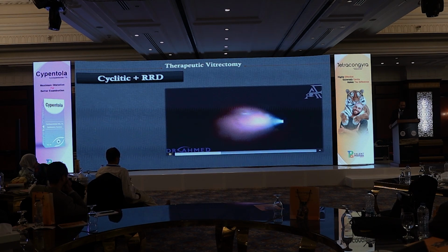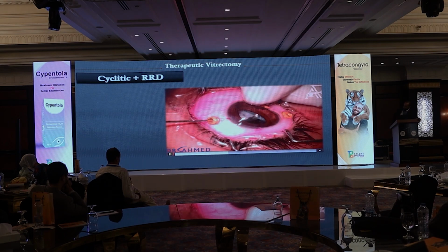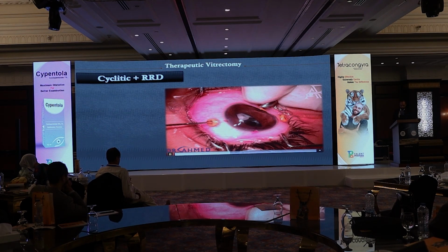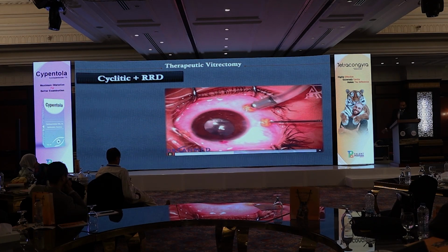So after a while, we just opened up to do the vitrectomy. We did the PPV, and you can find a superior nasal membrane extending to the anterior segment. Then we tried to remove the membrane from the ciliary body, and this is very important.